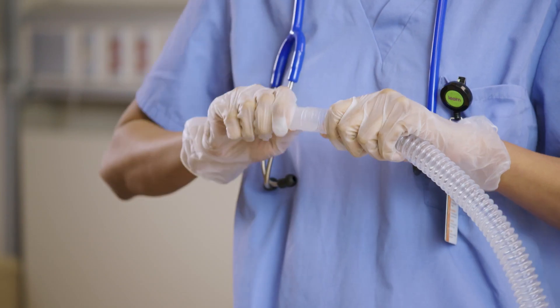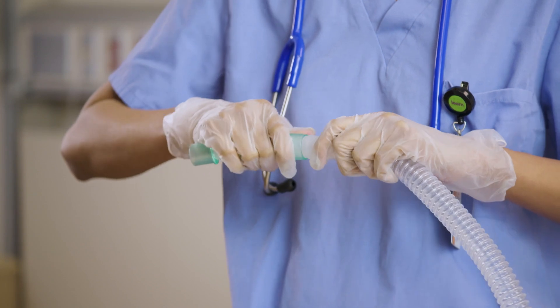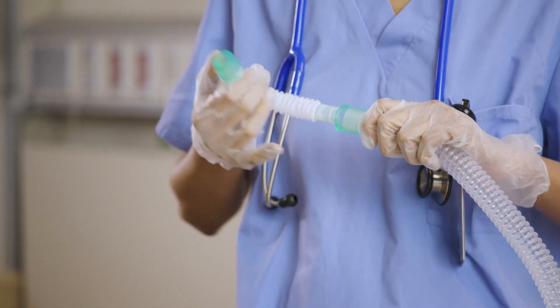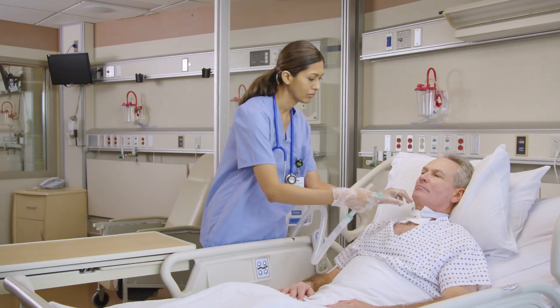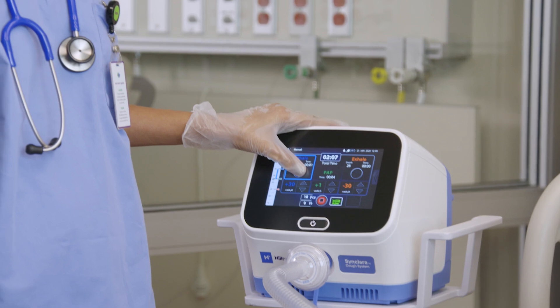While therapy is available in both automatic and manual modes, always use the settings prescribed by the physician. Before starting any therapy, make sure you have connected the applicable patient circuit to the system and that the patient circuit is placed into position on the patient. Then select the preferred therapy mode.